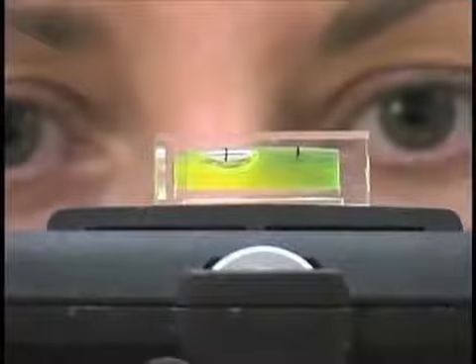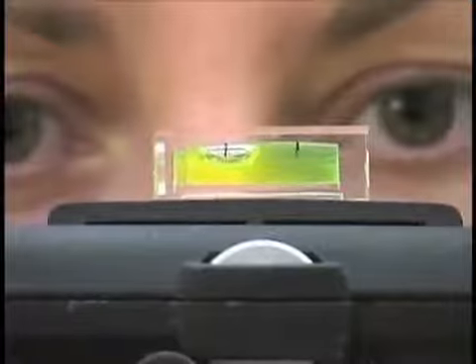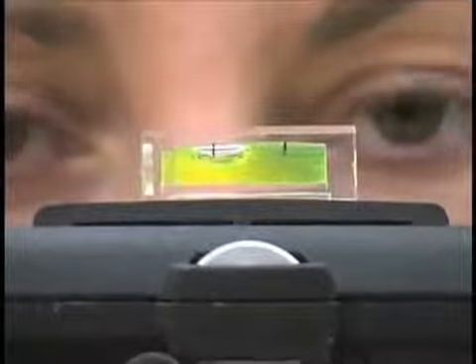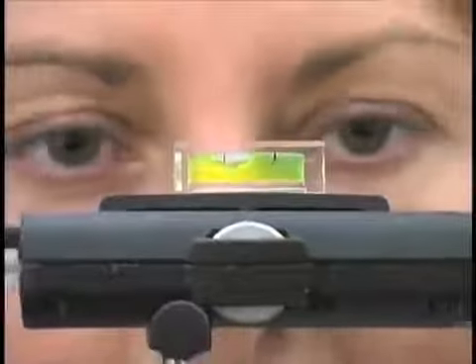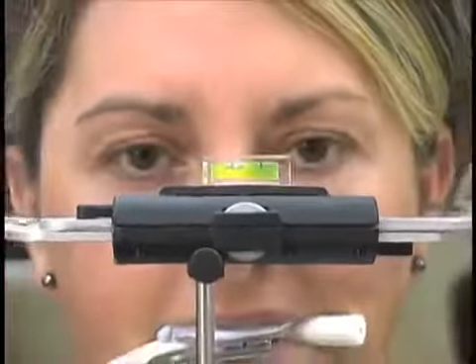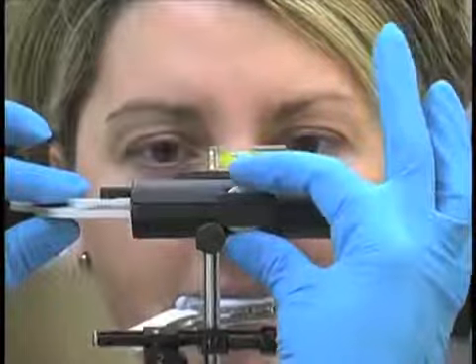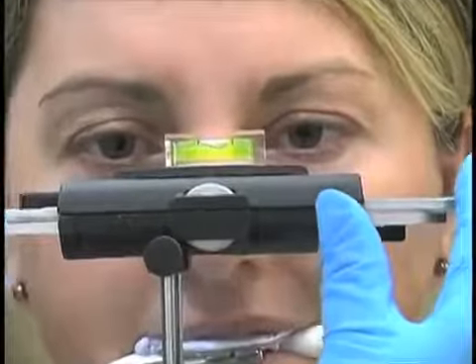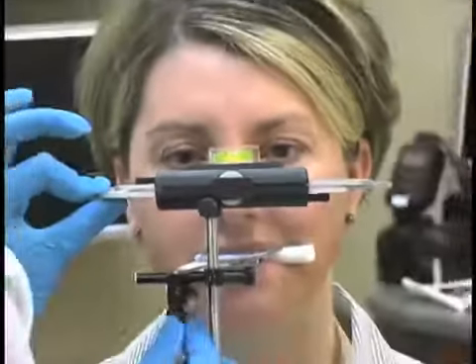And as Pete has said, using the interpupillary line is one option, but it is possible for that plane to be off. So I love the fact that Whip Mix has placed levels on the Facebow. So if you look at Ann now, notice that the Facebow is on her face. We've tightened number 1, okay, and got it right where it's supposed to be vertically. But now we're going to look at it horizontally, and we see that that bubble is slightly off. Without taking the Facebow out of the patient's ears, what Mariah can do is just very simply move it in the patient's ears till that's level, and then reach down and tighten the second one.